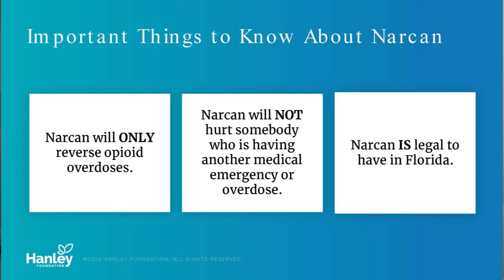Some important things to know about Narcan: it only works by reversing an opioid overdose. It will not hurt someone if they're not having an opioid overdose but are having another medical emergency. Giving someone Narcan is not going to cause any major reactions that will harm them. It is legal to have in Florida, so you don't have to worry about carrying Narcan.